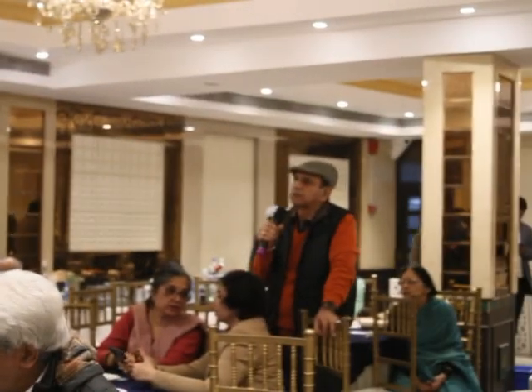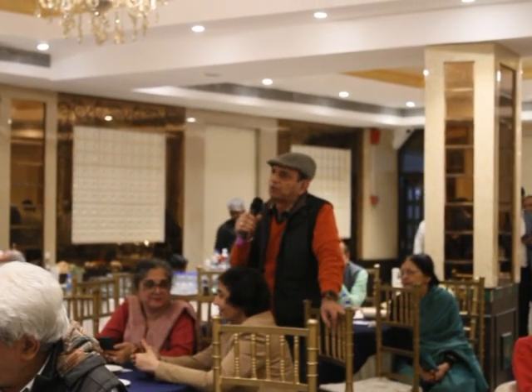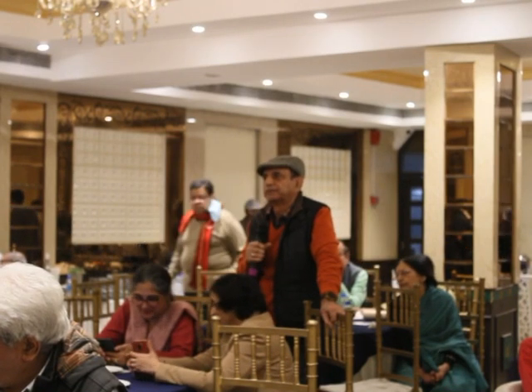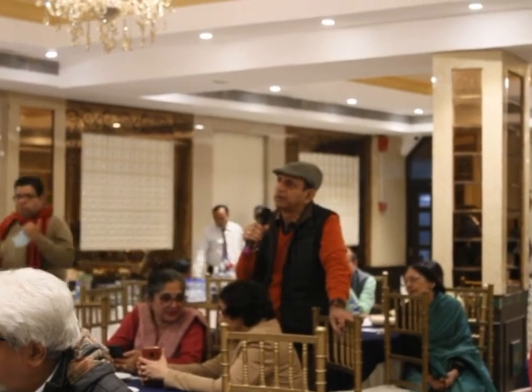Dr. Bhalla, sir, we lost a patient of neurocysticercosis with multiple foci in the brain. In that particular case, was radiosurgery possible? No. When you say multiple neurocysticercosis, we can only excise the accessible areas and the rest is medical therapy. There is no radiosurgery for that.